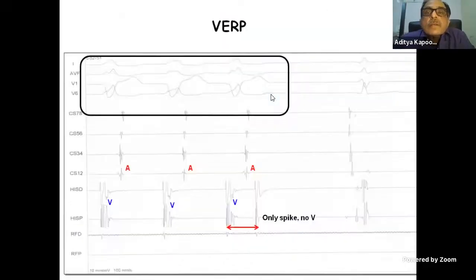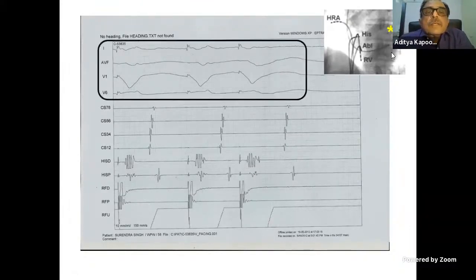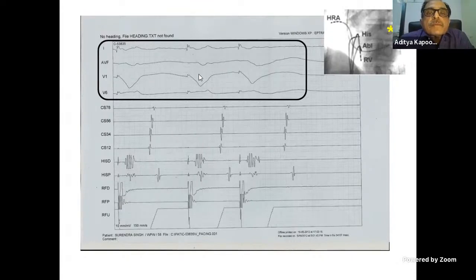Yeah, go on. So now you look at this tracing. Theoretically, I have just drawn these figures over here, and this patient, you see again the RV pacing. We are just considering RV pacing now, and I'll keep on repeating these facts because they'll stay in your memory for a longer time. So you identify the chamber being paced, preferably from the surface ECG. You see there are 3 pacing spikes. Now you try to find out what the VA conduction is like.